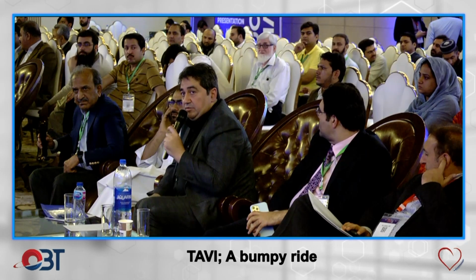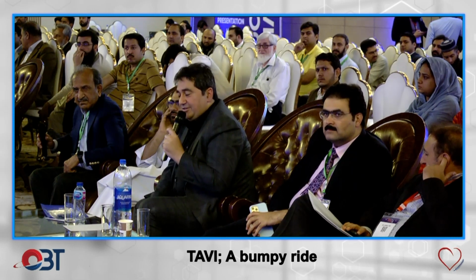I don't mean, sir, for diagnosis. I mean for the sake of prediction. Prediction of the stroke. Yes, but these are all things which add to make your procedure easy. So you pick up everything, I would say. But here it's apparent severe calcium. Yes, so you expect anything you would expect with a severely calcified lesion. I agree with that. You are in a gray area certainly. Stroke risk would have been very high in this patient.